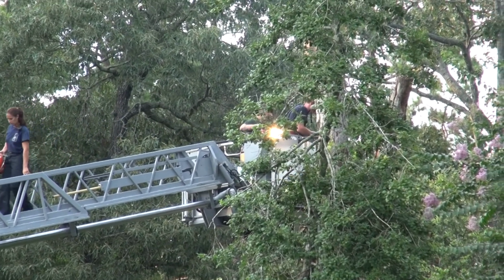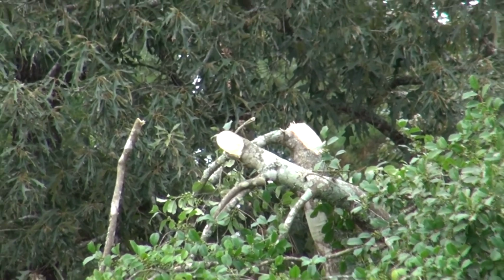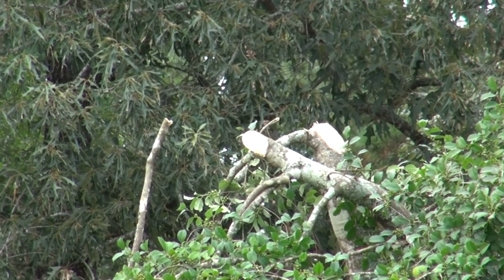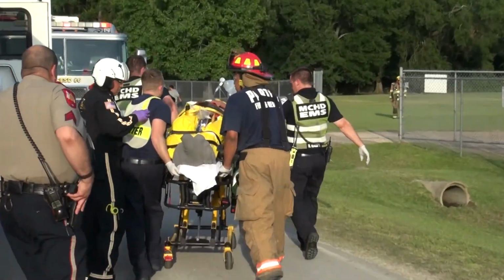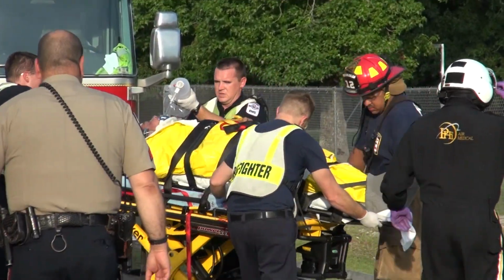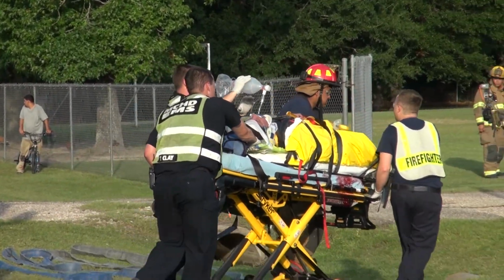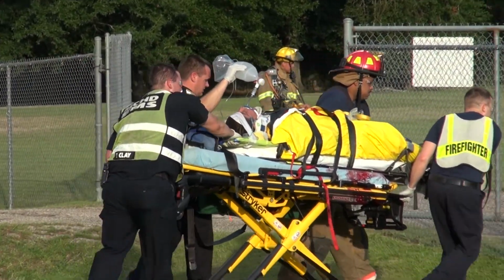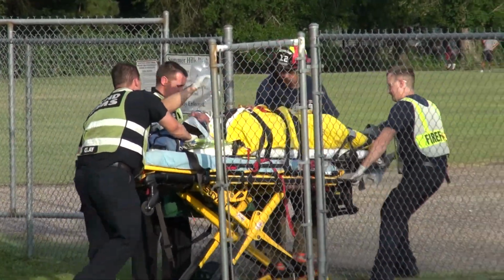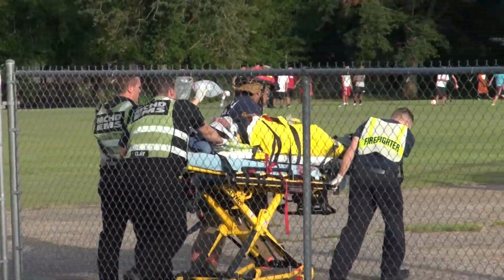Now, Kwik Clot's even available over the counter at pharmacies now for small cuts, or for people who basically bleed freely and such. How effective is that? It's shown to work very well. Again, in the civilian world, we're still working on studies to show its effectiveness versus traditional gauze management. But certainly, anecdotally, it's been very effective, particularly when patients have a bleeding disorder or are on blood thinners.